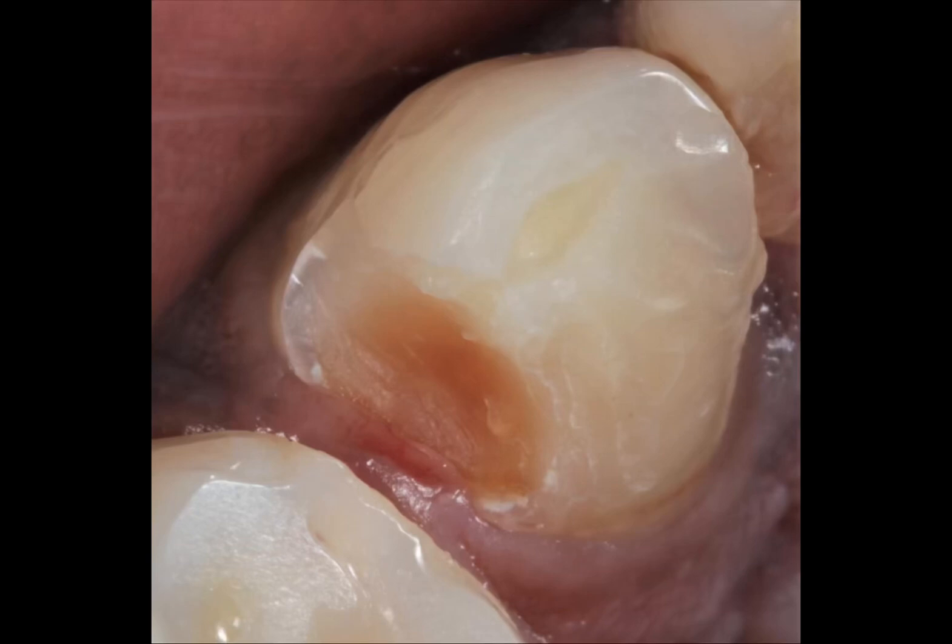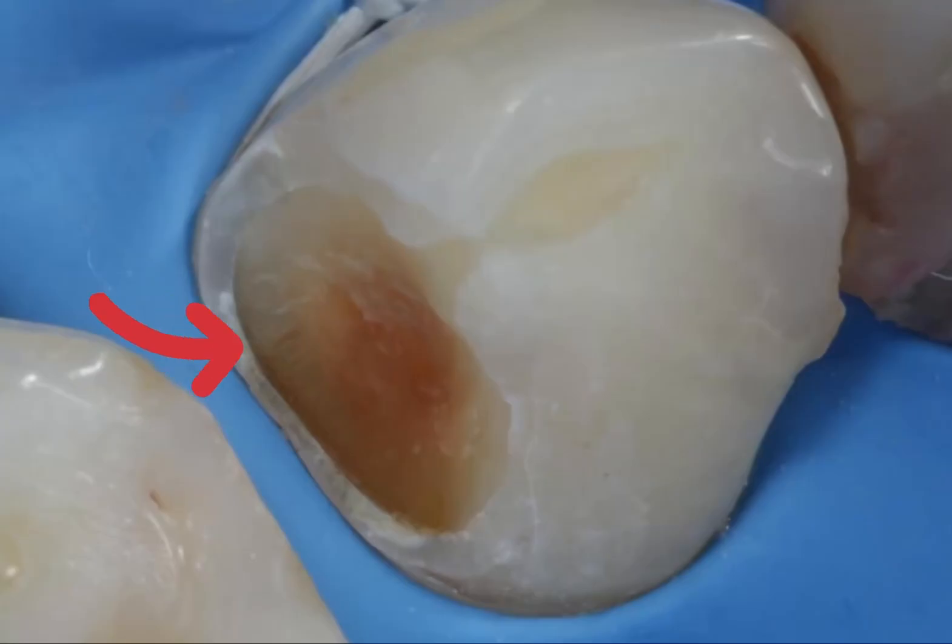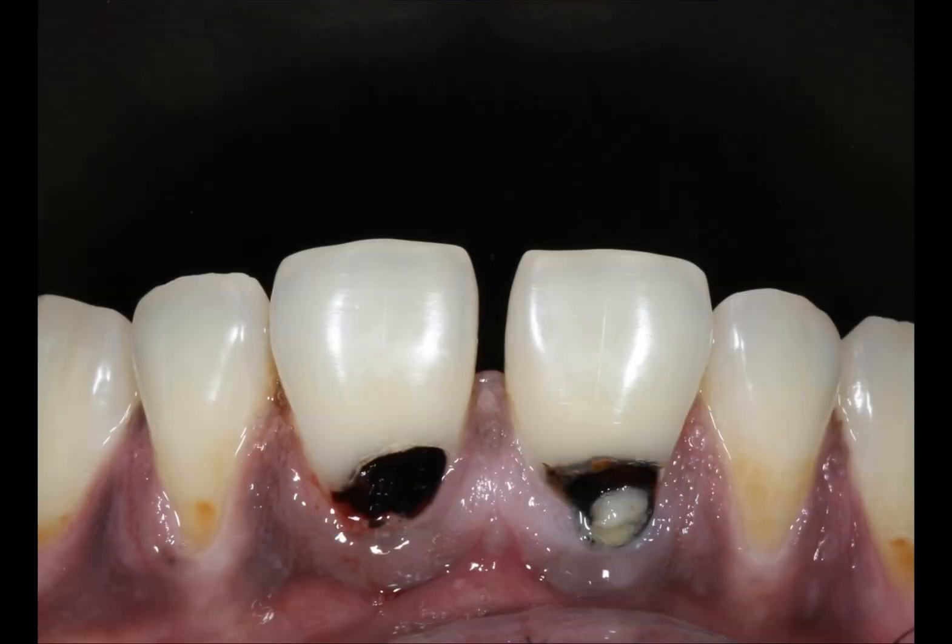Have you ever thought how you could isolate and bond a tooth where the gingiva is almost creeping into the defect? The only solution is to place a rubber dam and a double tie floss, get the peripheral seal of enamel exposed, and now get an adequate bond and seal with composites.